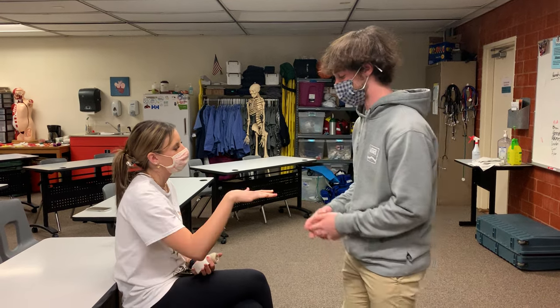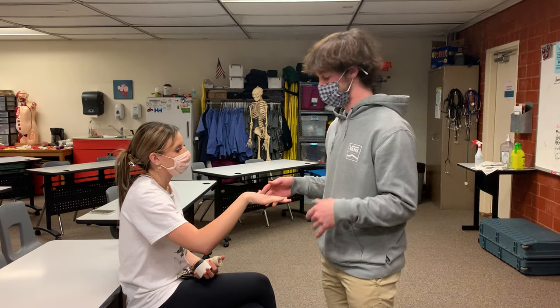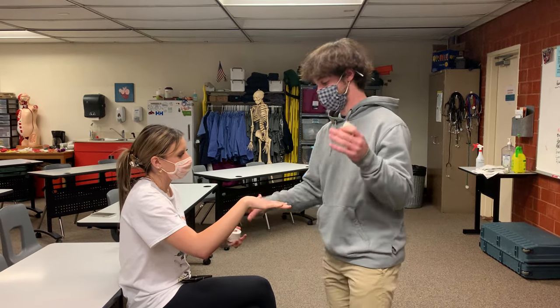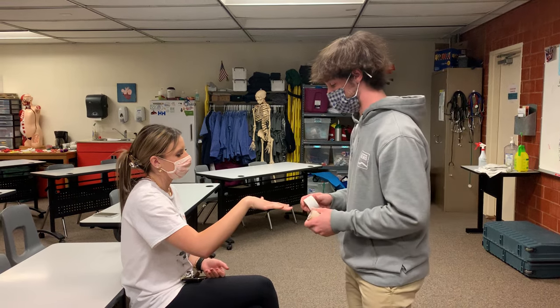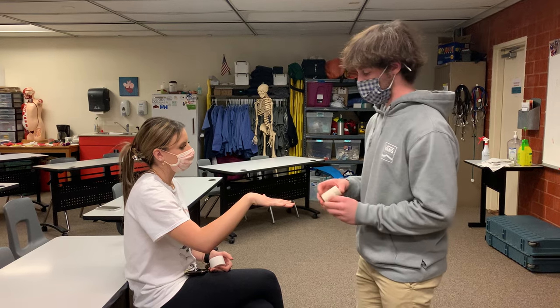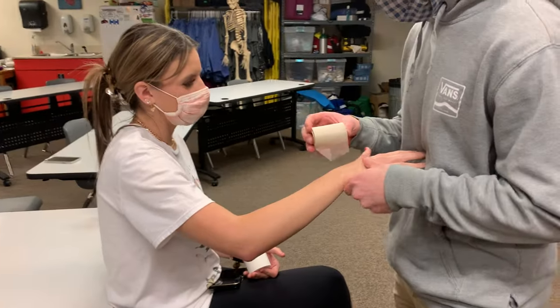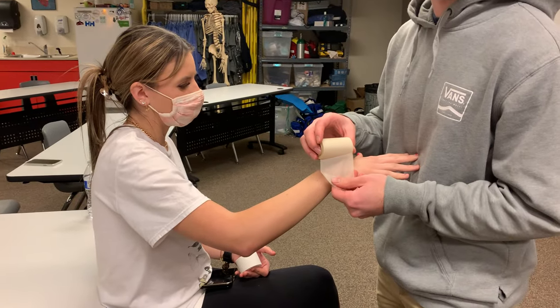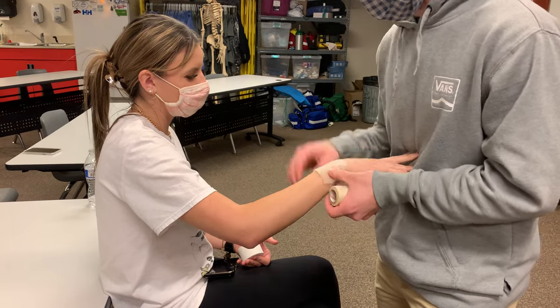To gather our stuff, we're going to need some pre-wrap, some tape, and some adhesive spray — which we don't have right now. Normally you would spray first, then apply a layer of pre-wrap to the hand and wrist.